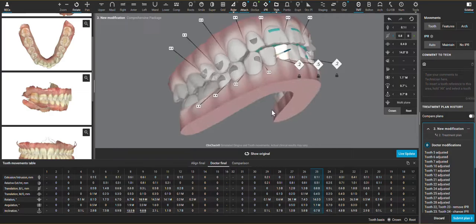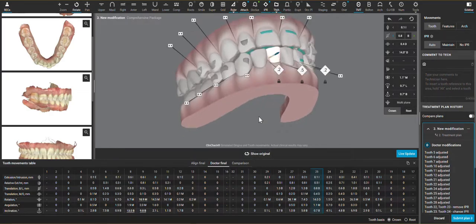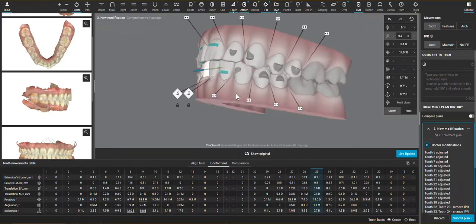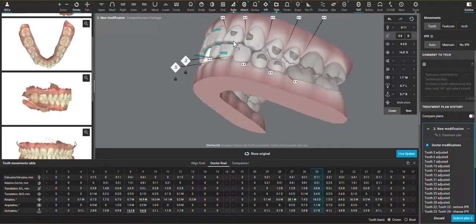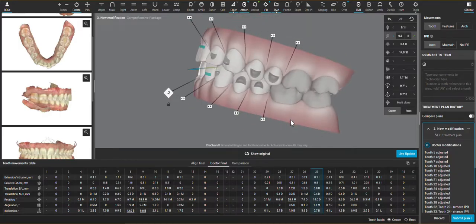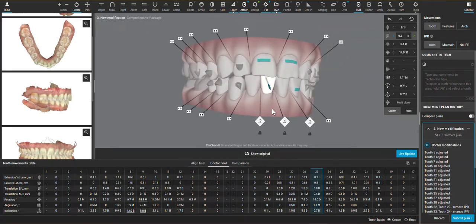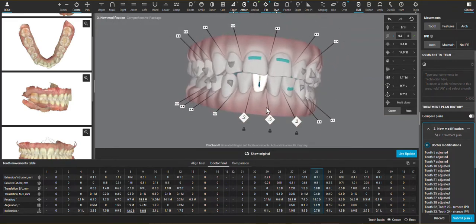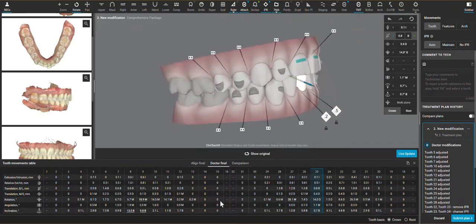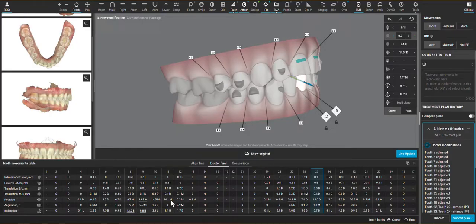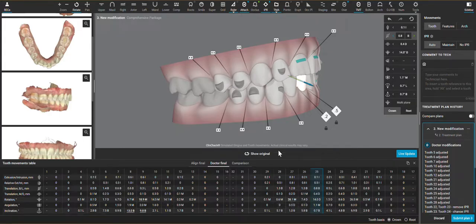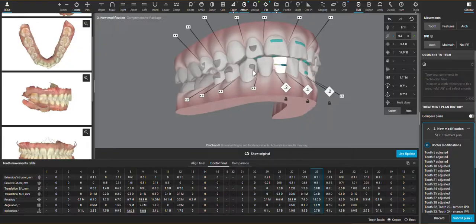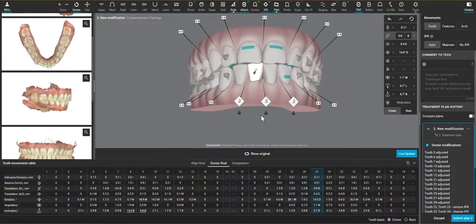And this looks like just about the perfect, most predictable ClinCheck to approve. Still bite ramps here to prevent the molars from passively intruding. And then retention attachments throughout the posterior. If one is good, two is better. And then making sure that we have rotation attachments on any and all canines that need to rotate. And then tip on canine rotation. So much more predictable when there isn't any crown and root angulation planned in.